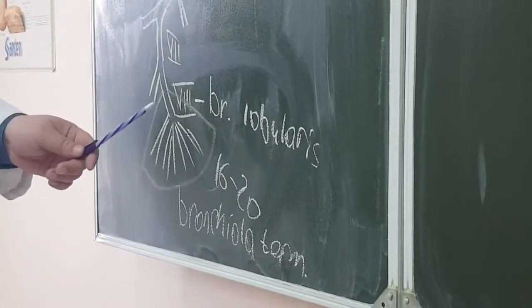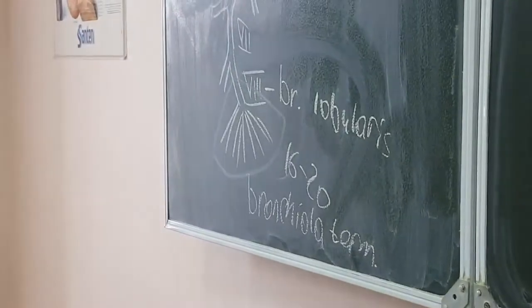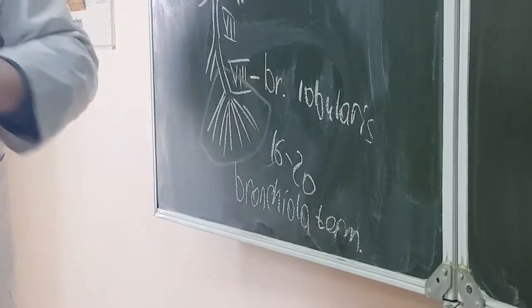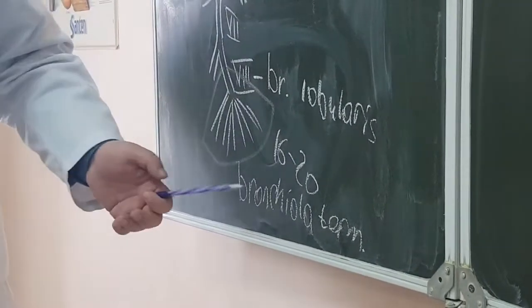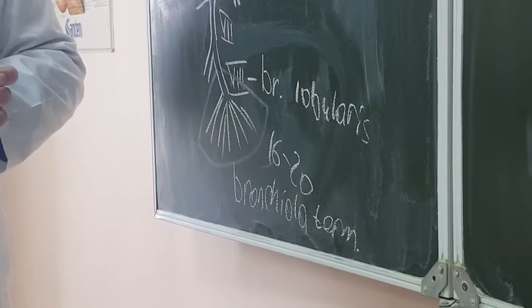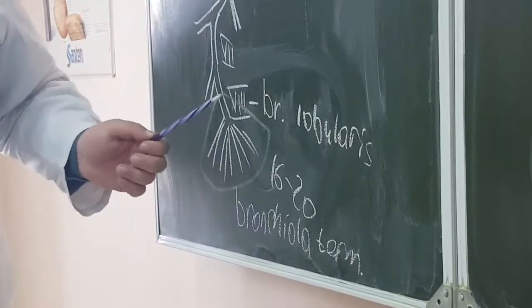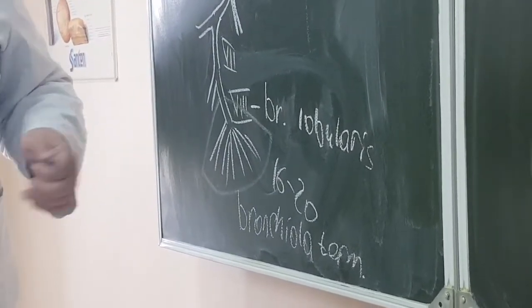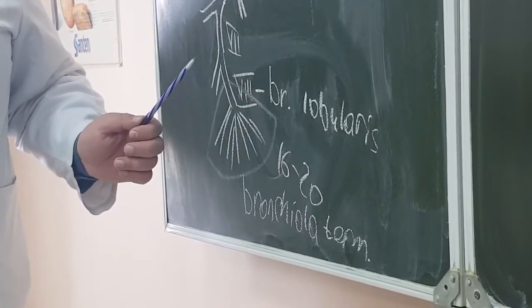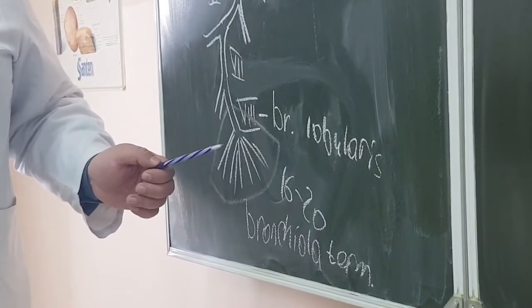But the wall of the bronchus has cartilage. Small drops of cartilage, but cartilage is present. In bronchioles, cartilage is absent, and the same in bronchioles terminalis, absent mucous glands, but ciliated epithelium is everywhere, here and here, and smooth muscles, the same both in bronchus and in bronchiole. There are no differences. Only cartilage is absent and mucous glands are absent.